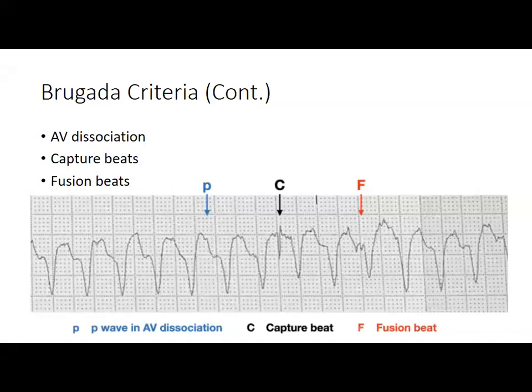What's happening here is this is a ventricular arrhythmia, but while you're in VT, your atria are still firing. For the most part, the VT is going really fast. It's causing refractory periods throughout the ventricle, but every once in a while, a normal, narrow complex ventricular beat that started in the atrium will poke its head through that VT, and that tells you, oh wow, this is an atrial beat that has made it through the AV node and is going down the His-Purkinje in a narrow complex fashion.